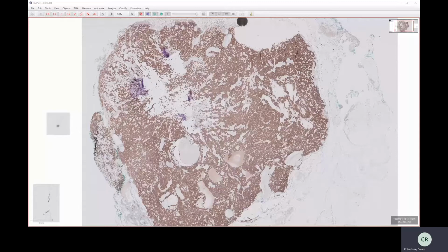whether it's in situ malignancy or invasive malignancy, based on invading through, for example, the myoepithelial layer in breast. So you stain using immunohistochemistry against the myoepithelial layer, and if the stain highlights the myoepithelial layer around the carcinoma, you know that's DCIS or carcinoma in situ. Whereas if there's no myoepithelial layer anymore, then that's become invasive. So staining the myoepithelial layer or the basal layer in breast or prostate and in some other situations is very useful in deciding whether something is malignant.